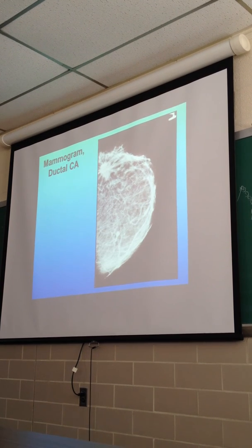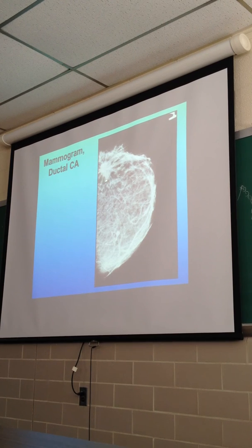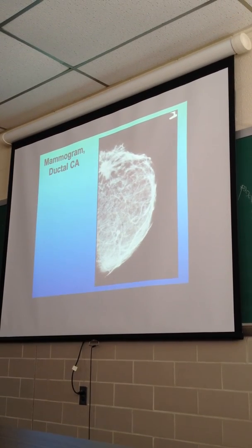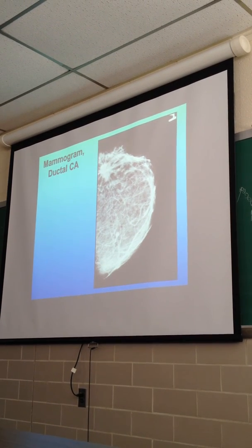Okay. You see something mass-like like that, and you're looking at it, that's really not well delimited, right? I mean, it looks malignant. You're going to have to do something about that.